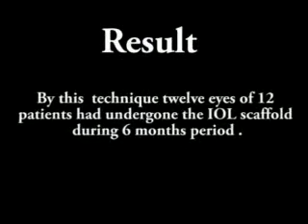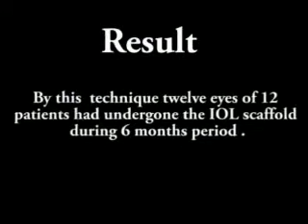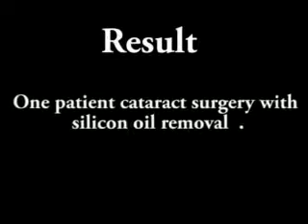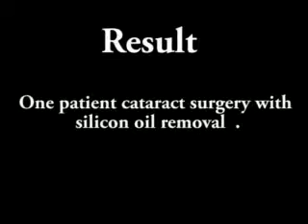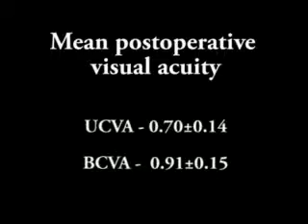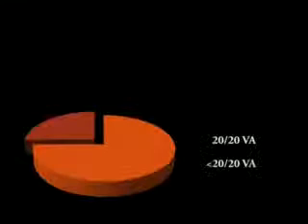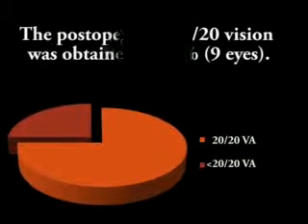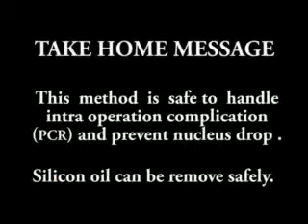By this technique, 12 eyes of 12 patients underwent IOL scaffolding, and one of the patients underwent cataract surgery with silicone oil removal. The mean post-operative best corrected visual acuity was 0.91 plus or minus 0.15. Post-operative 20/20 vision was achieved in 70% of the patients. So this method is safe to handle intraoperative complications and prevents nuclear fragment drops. Silicone oil can also be removed safely. Thank you.